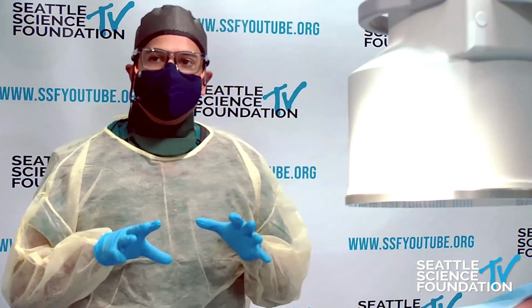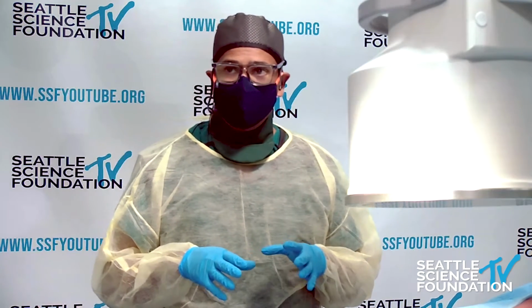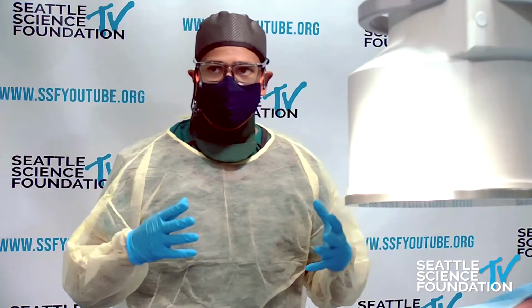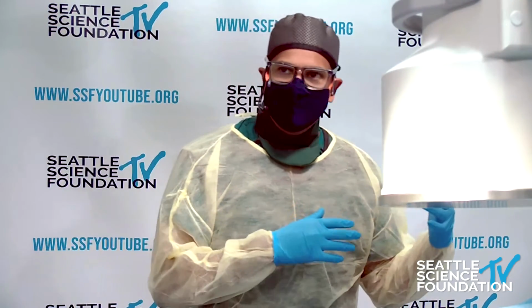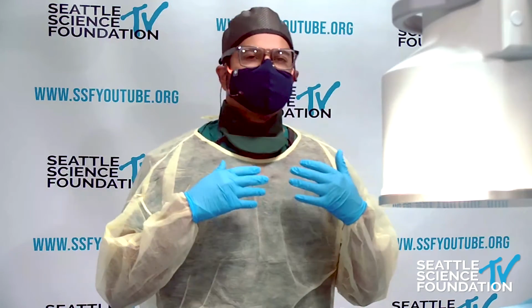There are many, many different indications for the use of this system for peripheral nerve stimulation. Recently, they did obtain head and neck labeling, so it does allow for use for the head and neck. But you'll see it used everywhere. Last year, I did this for the shoulder. We do this for the knee, for the calf, for the heel, for the groin, for the forearm, for the wrist. So you can use this in so many places.